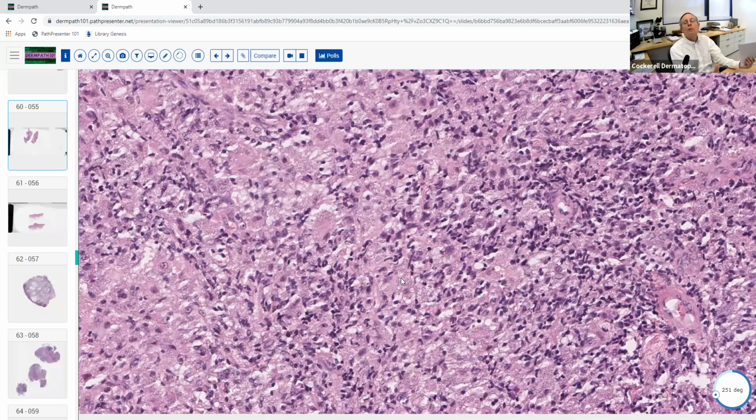Well, what do you get in Arizona? We just talked about that. That's cocci. So no, this isn't cocci. Traveling to Dubai. Well, what's endemic over in Dubai? Leishmaniasis. We already saw one of those. This isn't that, right? You see no marquee sign, and even if this were the Middle Eastern form, the organisms don't look like this. There's no capsule around them like you see here.